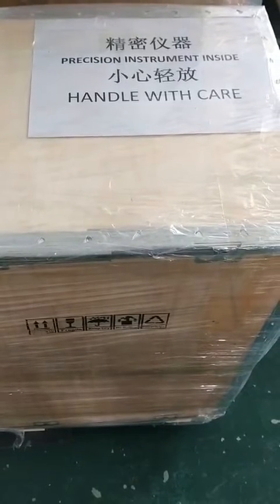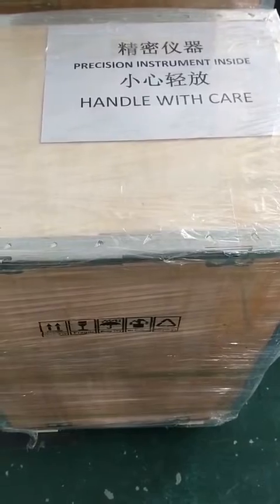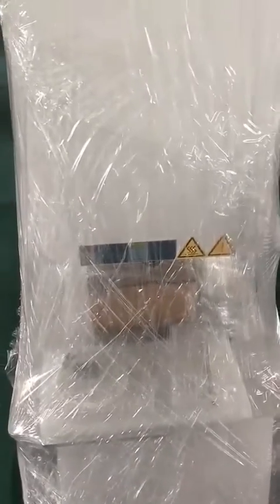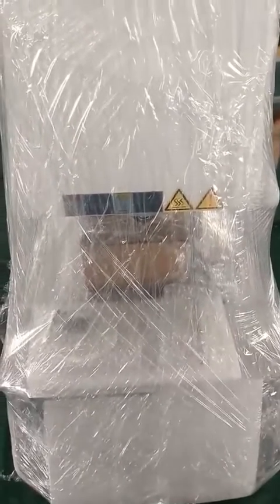When you receive your order, the porcelain furnace package looks like this. You need to open the carton and take out the porcelain furnace. The porcelain furnace comes with a plastic cover, and you need to remove the plastic.